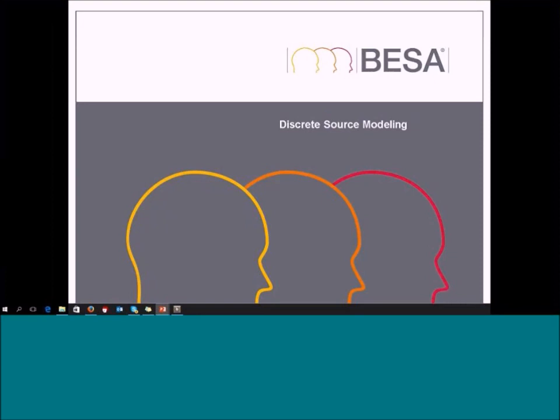It's a bit of a challenge to condense this material into the 3 hours, but I will do the best I can. And if there are any questions, please interrupt, and we'll discuss that then. So let's start with discrete source modeling.